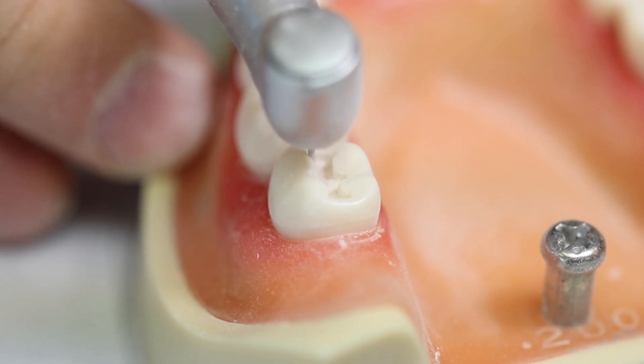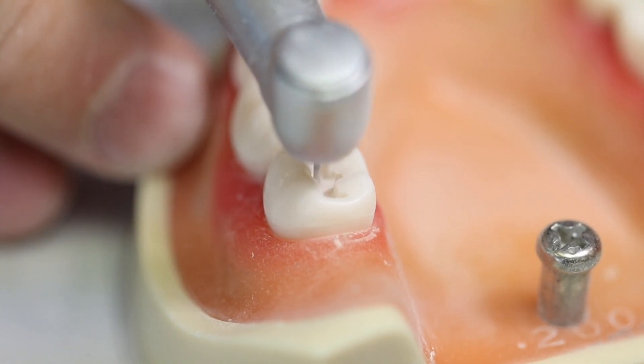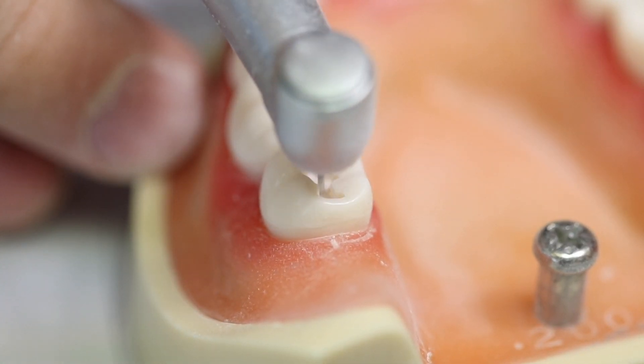Smooth the floor, smooth the walls, and make sure there are no sharp or flat walls.